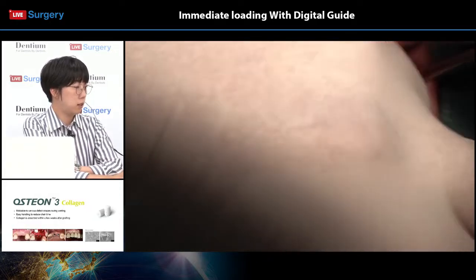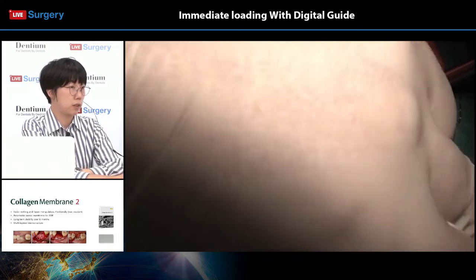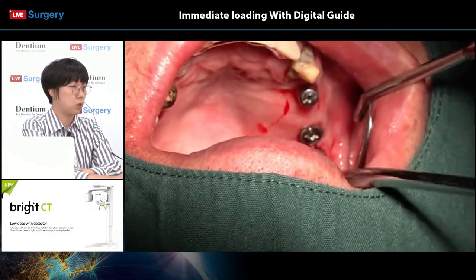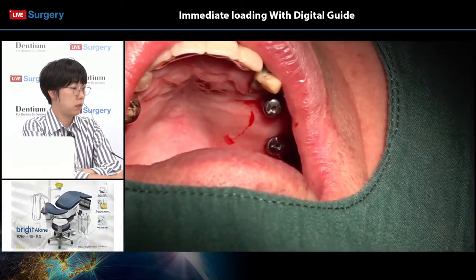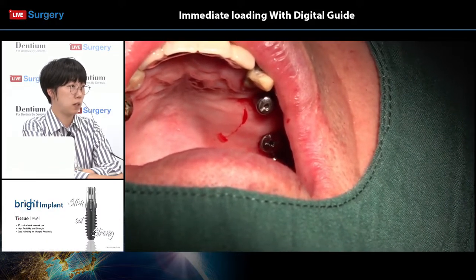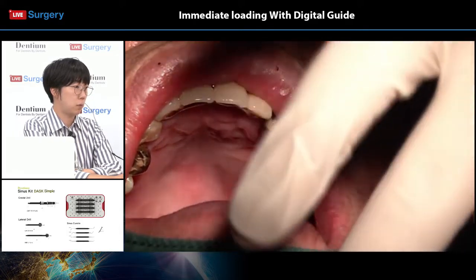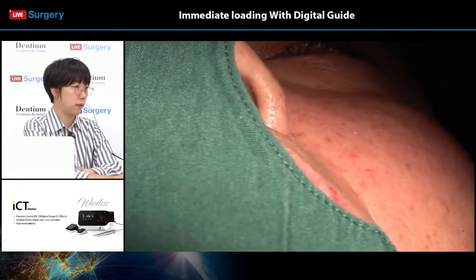On another note, initial stability can be checked with various instruments that are available in the market. EasyCheck from Dentium is one of these products and can be used on the abutment level. A recommended number from this device is reported to be over 65 for immediate loading cases. Maybe Dr. Lee will check on the temporary crown on tooth number 16 and 17 area before finishing today's surgery.